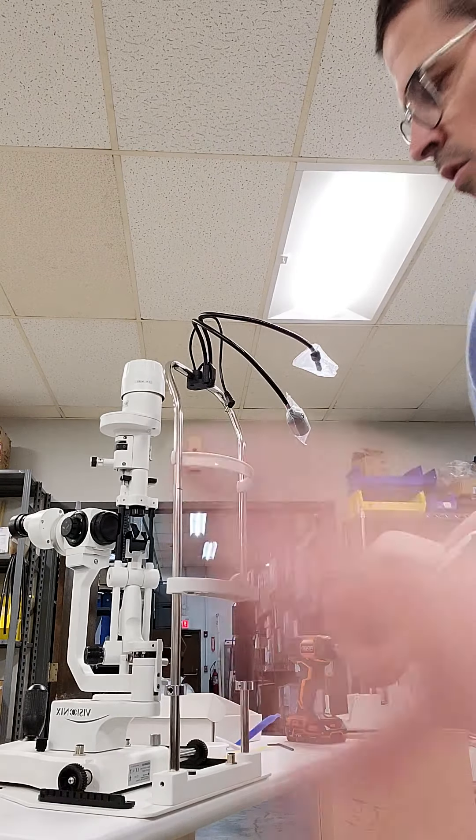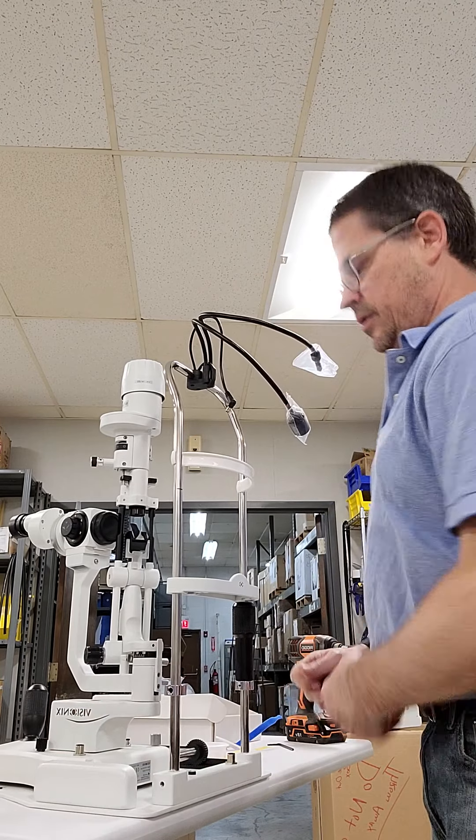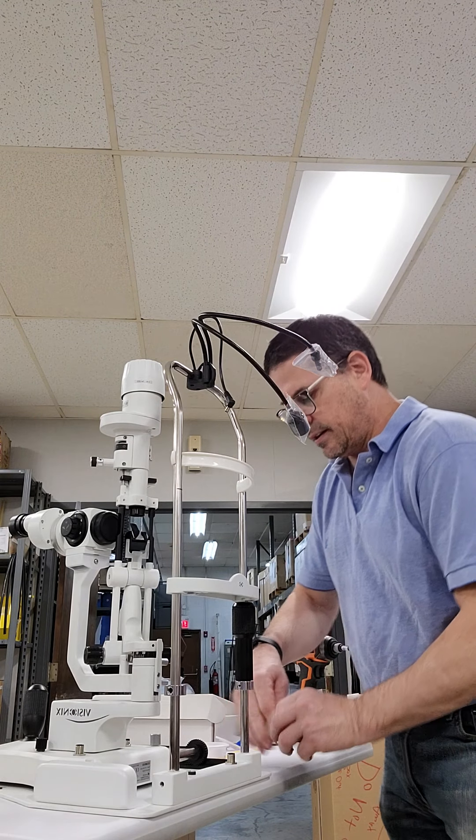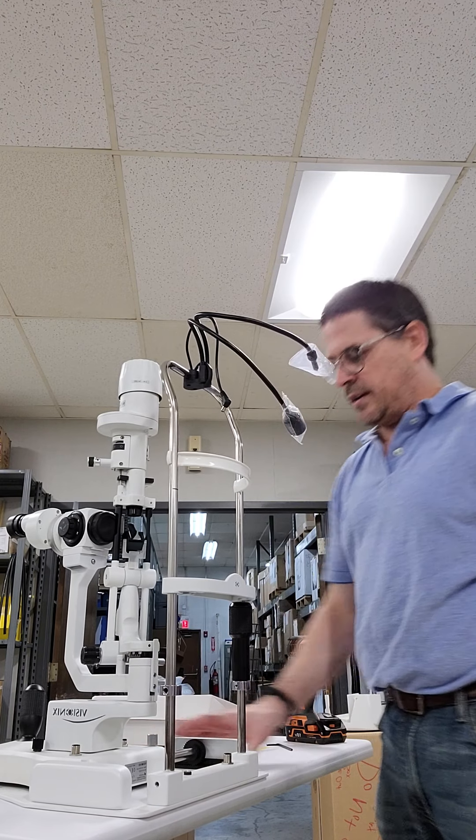Your guard rails are going to go in just on the edge. You slide them under here and they should just snap in and be tight. They go underneath, and that's just to keep the slit lamp on its guides.